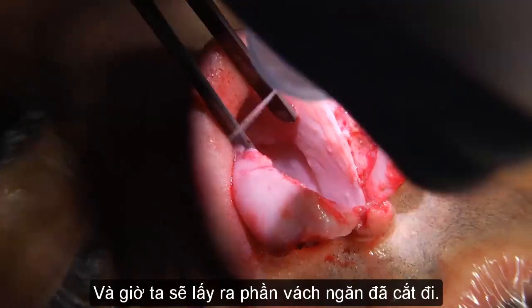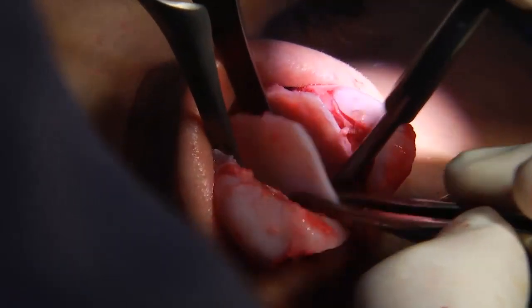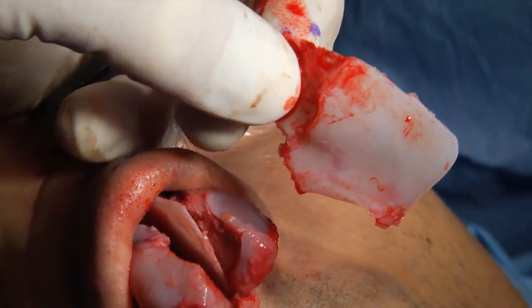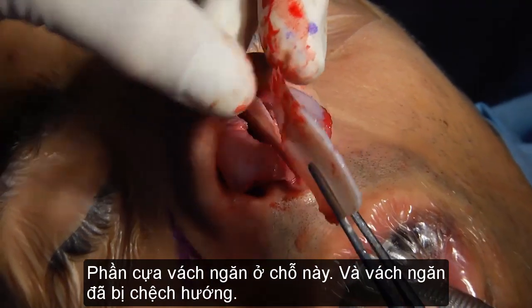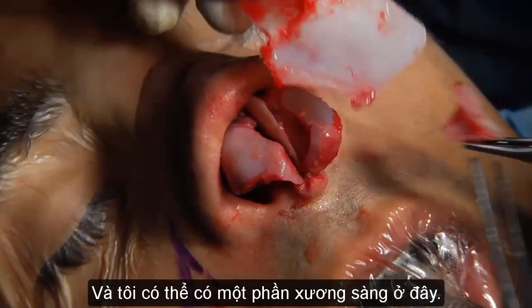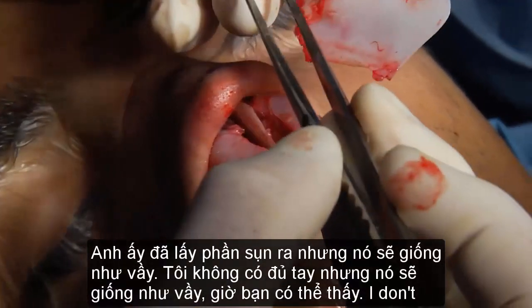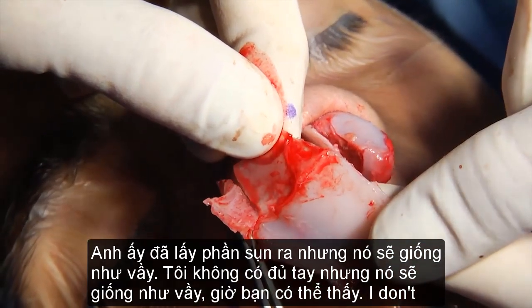Okay? And now let's take out that septum left here. And you see that the spur was down here. Did you keep it? The septal spur, no, was here. And this was the deflection. And I can have an ethmoid. Okay, so he took the cartilage out, but this thing was like this. I don't really have my hands free. It was like this, okay? Now you can see it.